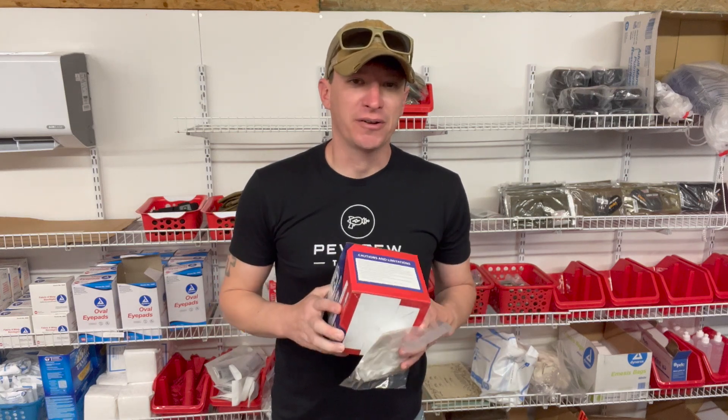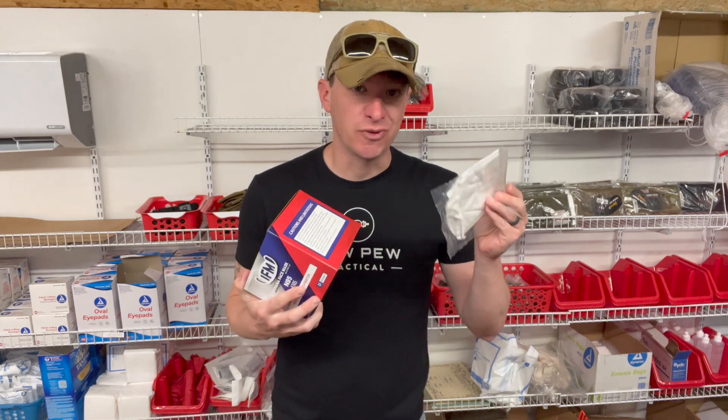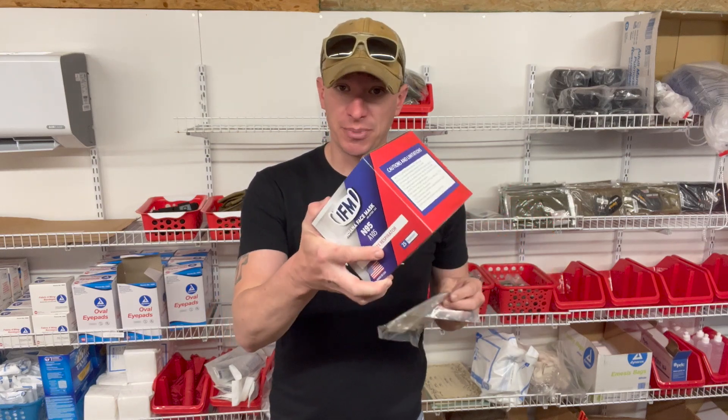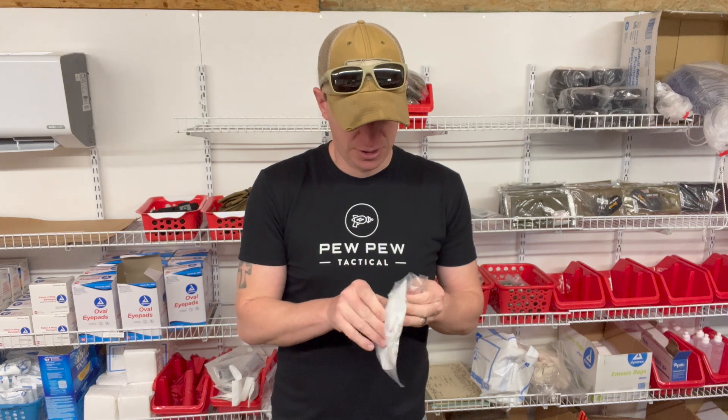Hey, welcome to another product review from Medical Gear Outfitters. We do have masks — we're probably out of that season, fingers crossed — but we do have them. I use these when I'm cutting grass, when I'm around sick people, things like that. You can buy American-made N95 masks on our website by the box, or we have them individually if you just want to throw one in your kit.